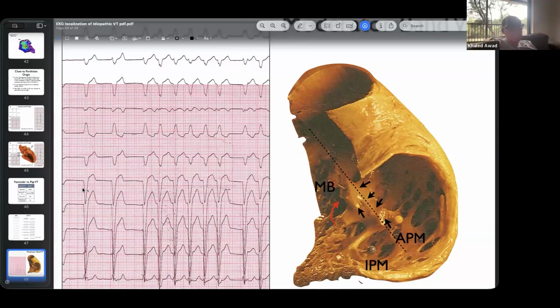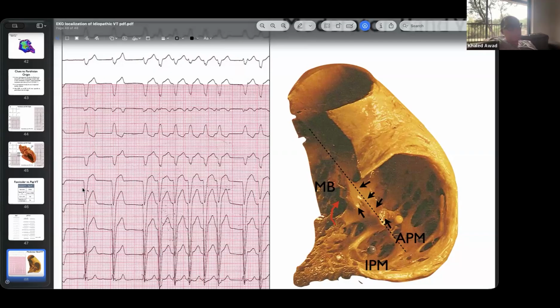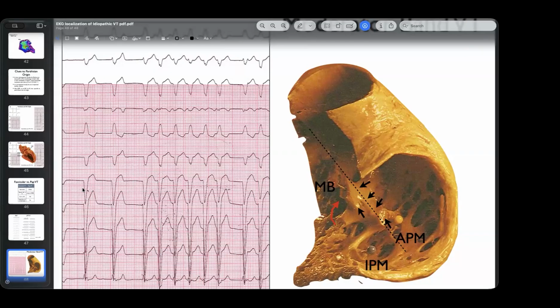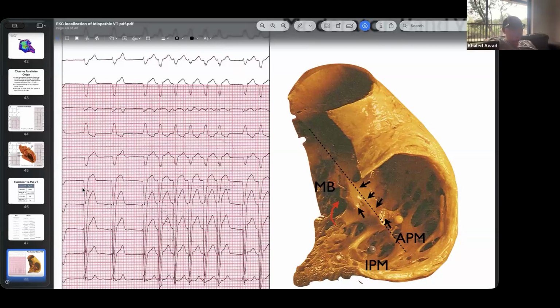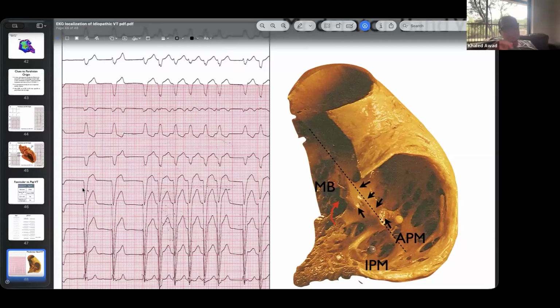If you go to the left side and it's late, then what I would do, when it's a wide area, we're talking about the CARTO red zone, right? What I do is I tell the mappers, narrow your red zone, narrow your spectrum. They push their window to make the early, and instead of anything that is 0 to 30 being all red, I want them to make it only 20 to 30. Then it becomes a much smaller area, and sometimes you just have to go through all the points they have and see what is wrong. Sometimes one point can make it look like that, one wrong annotation, that kind of thing.